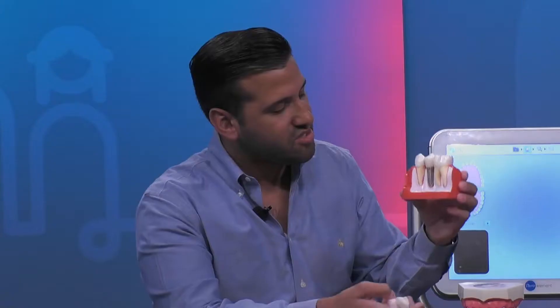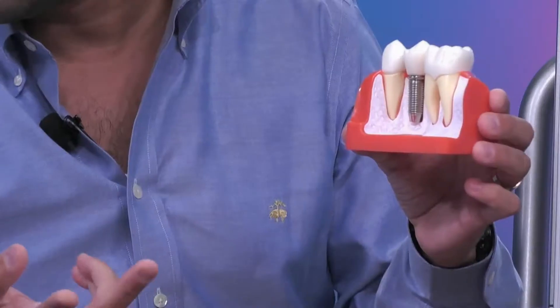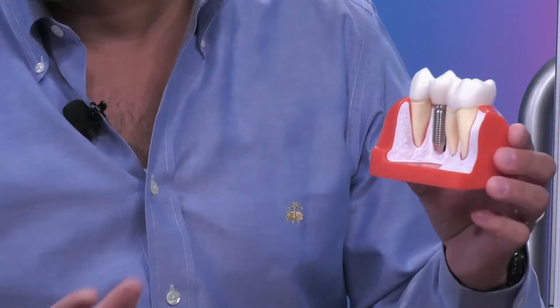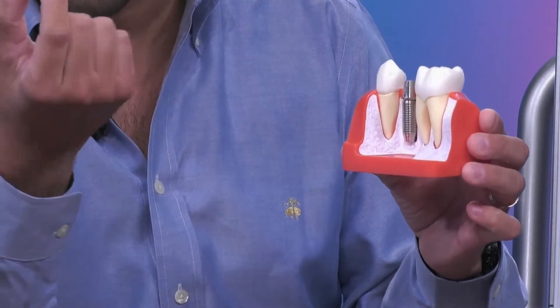So this is a model. I use this model every single day at my office — I probably use it with every single new patient that comes in. It basically describes a couple of different things. The model here shows an implant right here in the middle, and the implant is composed of three different parts. The actual implant is this screw-looking thing, and obviously it's not that big in your mouth — this is just for show-and-tell. So it comes in three different parts: you have the implant, and then you have the crown that sits on top.